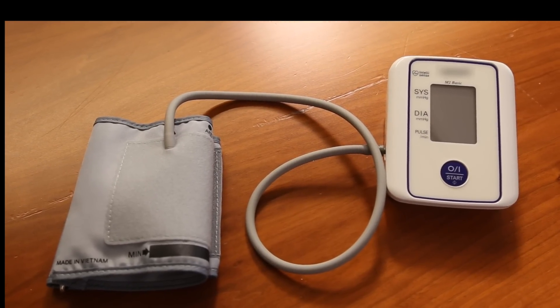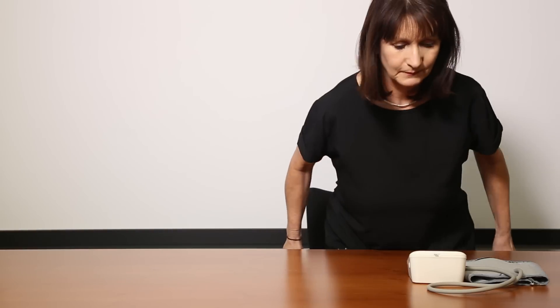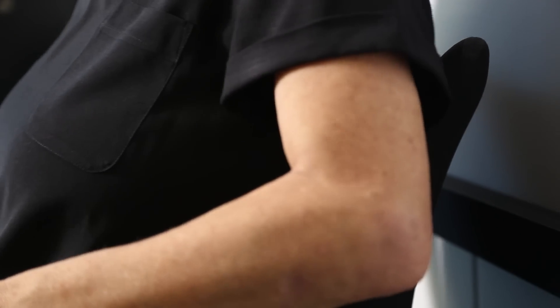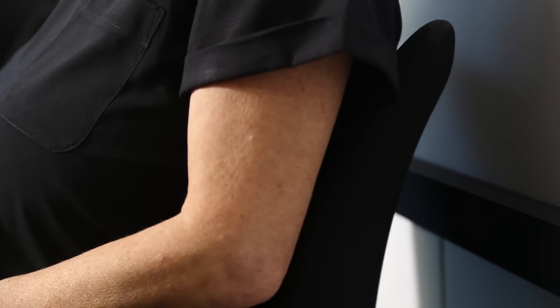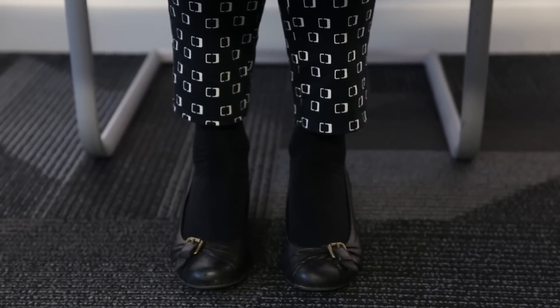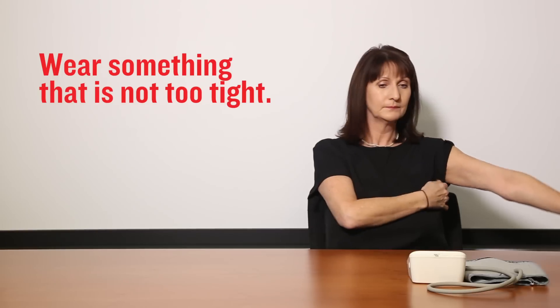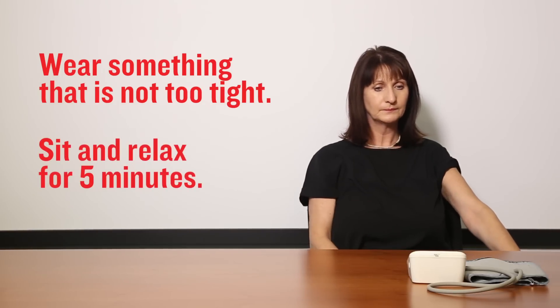Aim to take your blood pressure at the same time each day. Sit comfortably in a chair that supports your back and have a desk or table in front of you. Keep your feet flat on the floor and don't cross your legs. Make sure you're wearing something loose enough to allow you to uncover your upper arm and that isn't too tight. Then take five minutes to sit and relax.